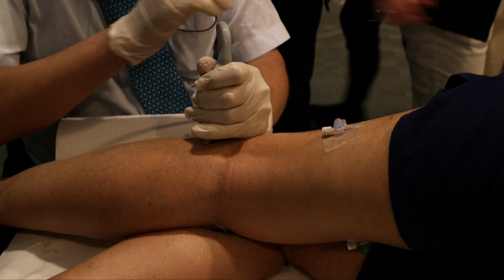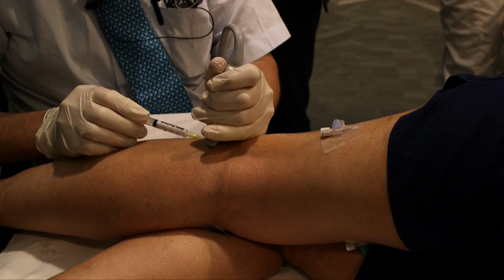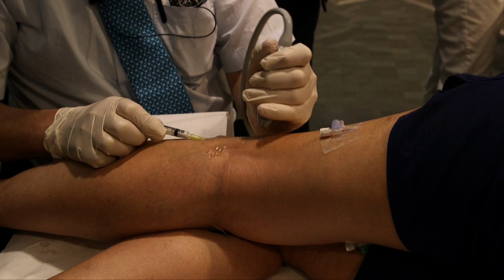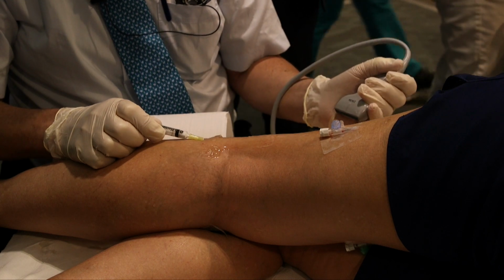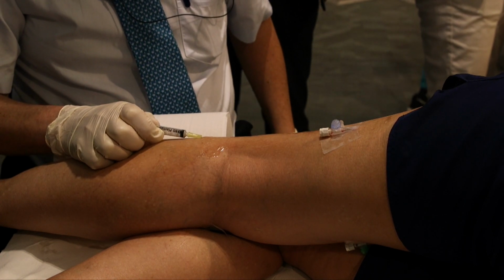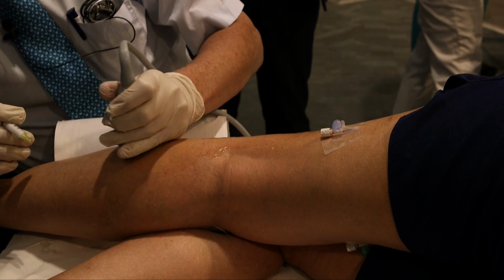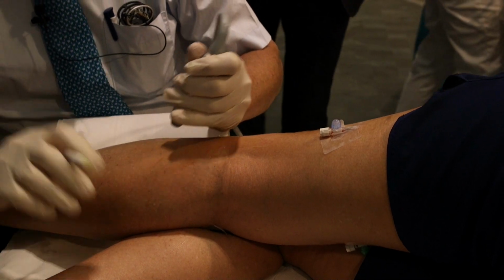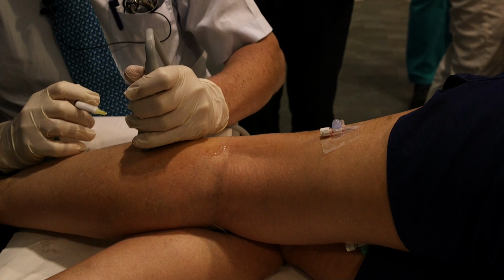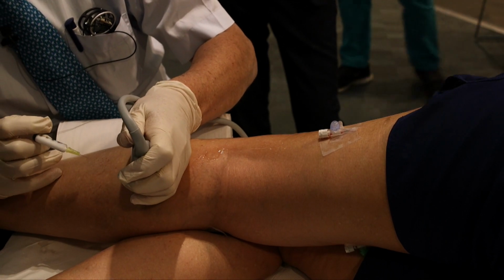Same again. So we go just a little bit further up. Little injection in here. So that's looking promising. And you'll notice what I'm doing is injecting starting at the top and working down, and that is because foam tends to run up the leg if you inject it down here, so it would obscure my view of the vein further up. This technique is very similar to the way in which the French phlebologists treat the veins.